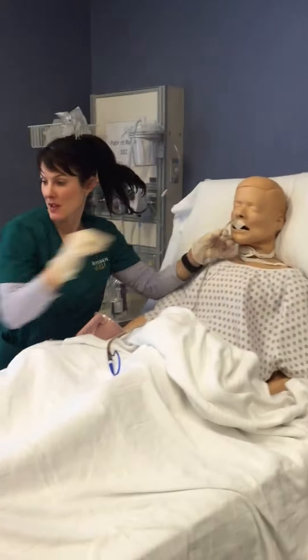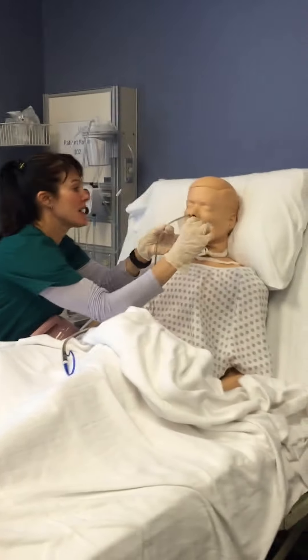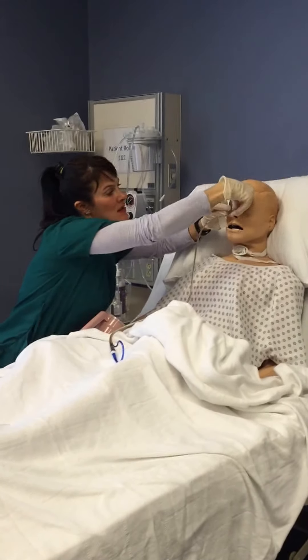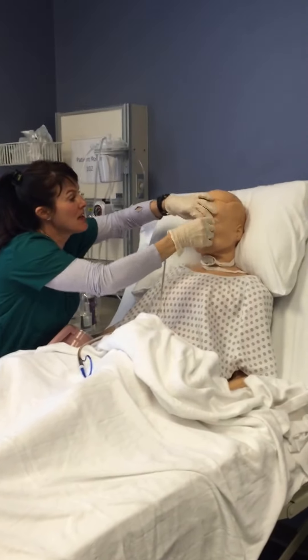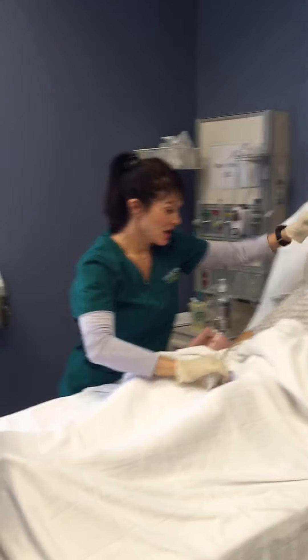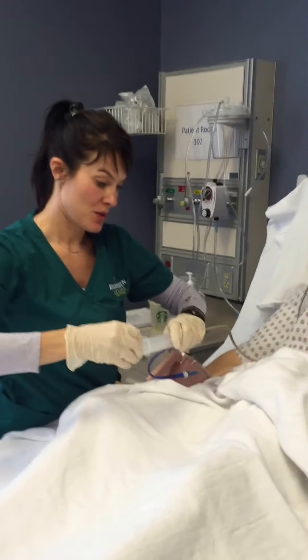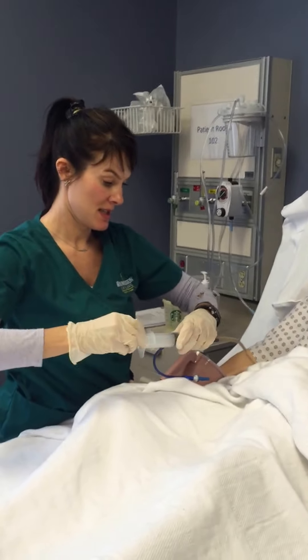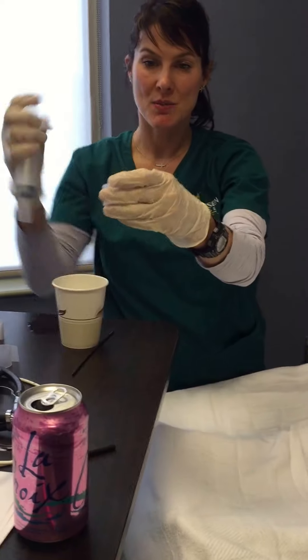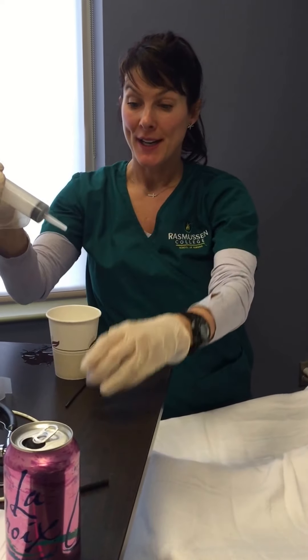It looks like everything went well there. I'm going to secure my line. So I've secured my line. Now I'm going to make sure I've got confirmation. First things first, I'm going to withdraw, looking for gastric contents and checking my pH. I'm going to use a pH stick, looking for a reading of three to five.